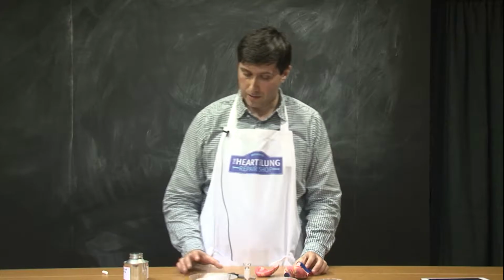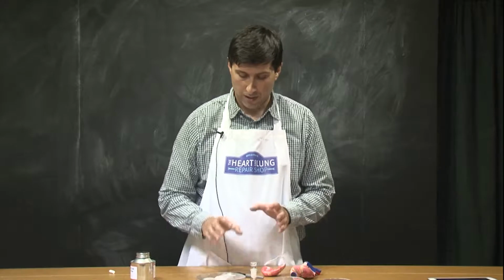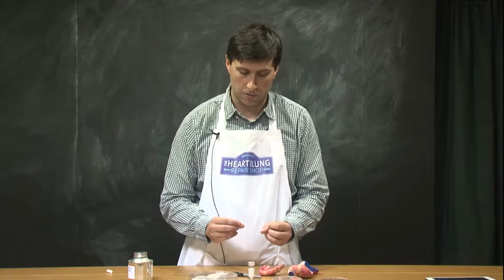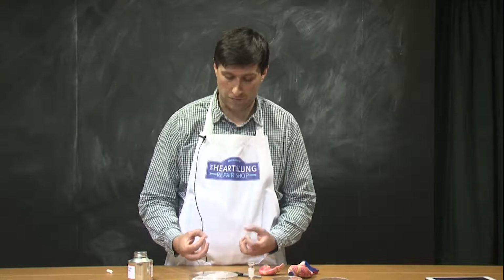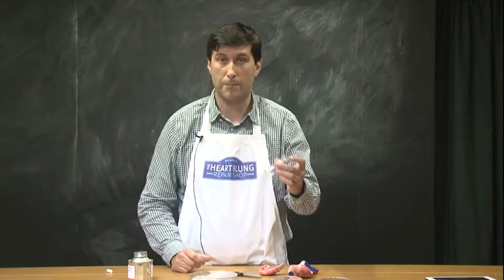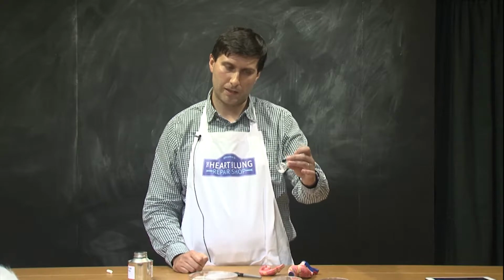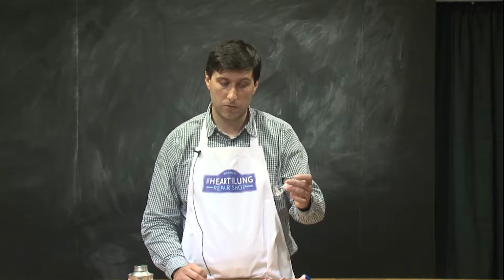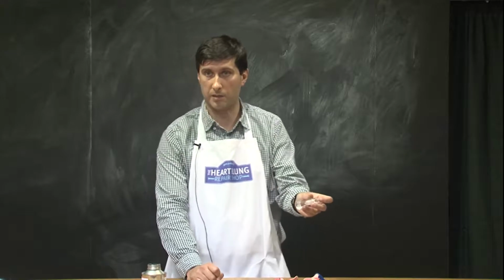There are main components to a tissue engineering approach. The main one is the kind of material you're going to use to create your tissue, which we use to create what is called a scaffold. What I'm currently using is a material called polycaprolactone, let's call it PCL for short. It's a plastic, a polymer, normally mixed with PVC in plastic bottles, for example.